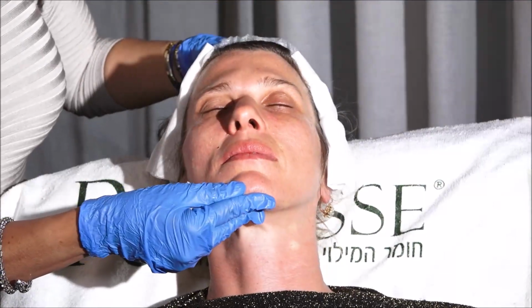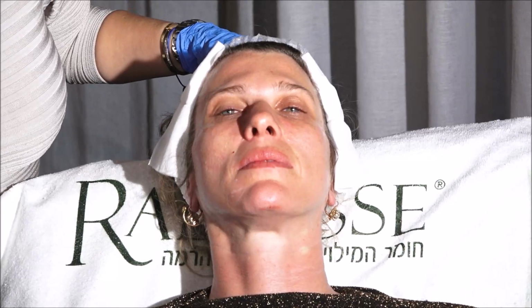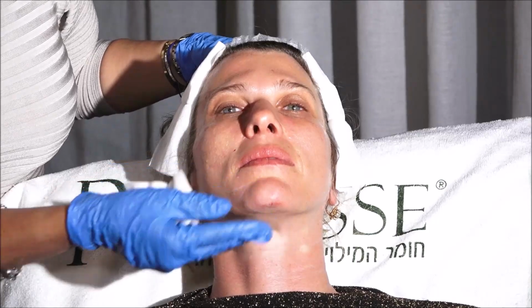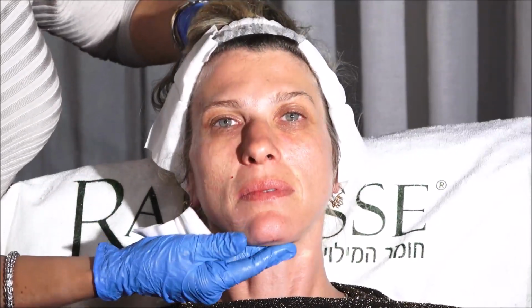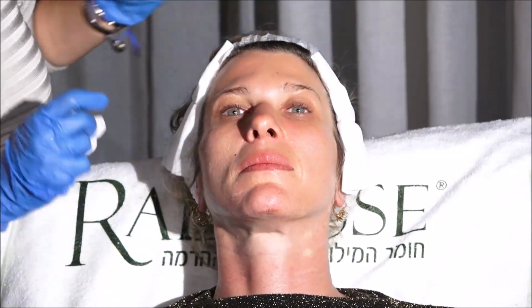And let's see how it looks. There's no more sagging. Of course, you had some correction because I did the chin already on one side, so it pulls the anterior neck. And you can see a difference in her face. So you see an enhancement of the vertical height just by looking at her jawline on this side, and more sagging on this one because we didn't do the radius yet, so there's less volume on this side. And then we're going to move to the volume.